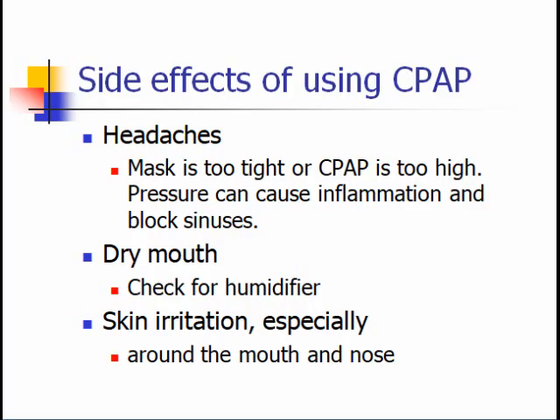Skin irritation can occur especially around the mouth and nose, and more frequently when too high of a pressure is used to hold the mask on. Tightening down those straps can cause the irritation. Even wrong size mask can cause irritation of the skin.